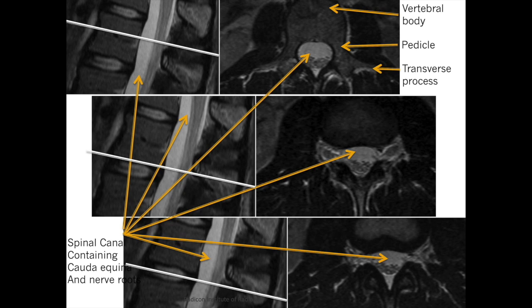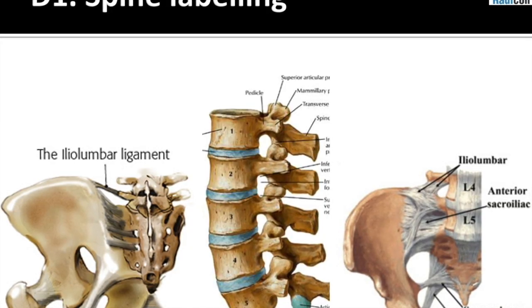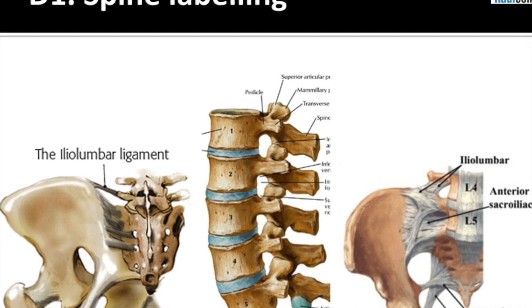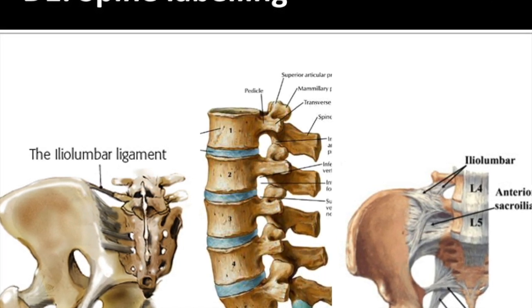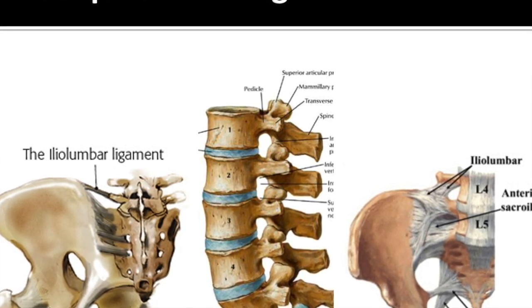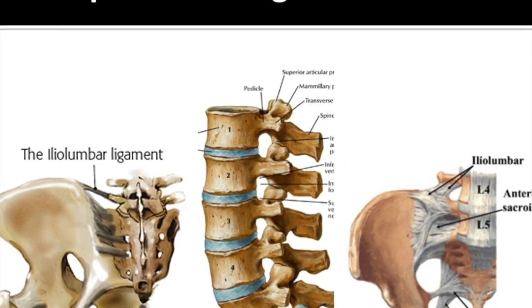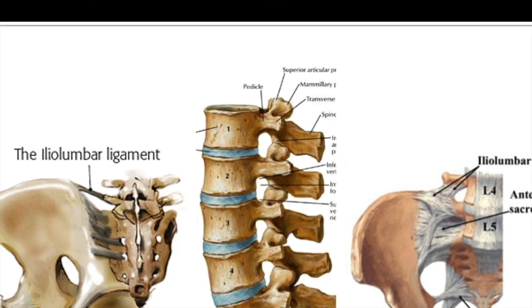The first sequence on the top left shows a slice through the upper L2 vertebral body, which is at the level of the pedicle. We need to remember that the pedicle occupies the upper 50% of the vertebral body height, and the nerve root is tucked just below it due to mismatch between vertebral column and cord levels. The nerve root comes off the cord at a much higher level but exits the vertebral column at a much lower level, arcing around the undersurface of the pedicle.